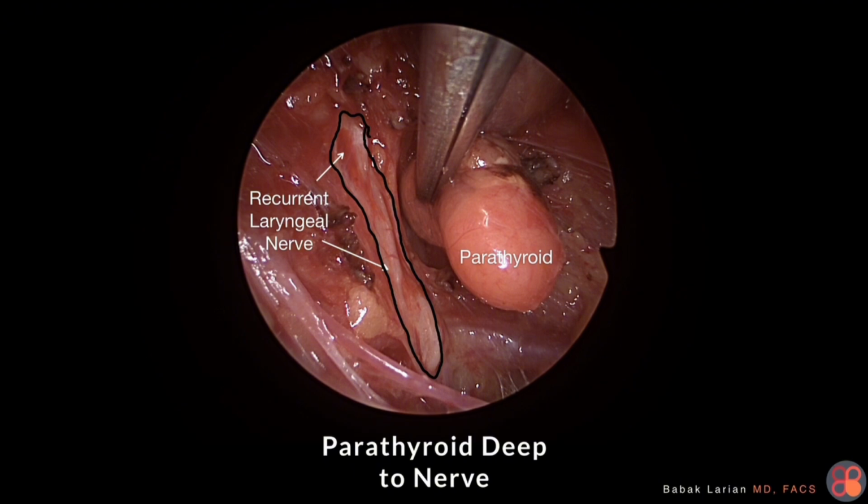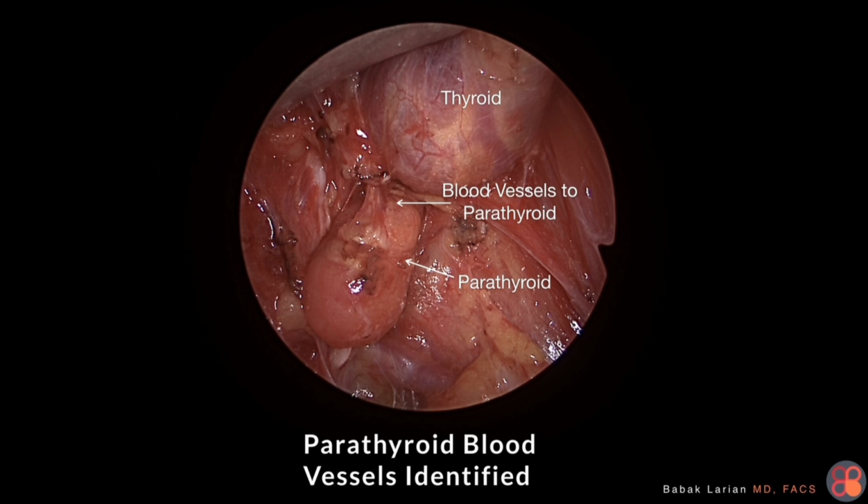Okay? And you can see this parathyroid being grasped by this instrument and pushed away from the area of the nerve. So again, gently doing the surgery so that you can protect the nerve.